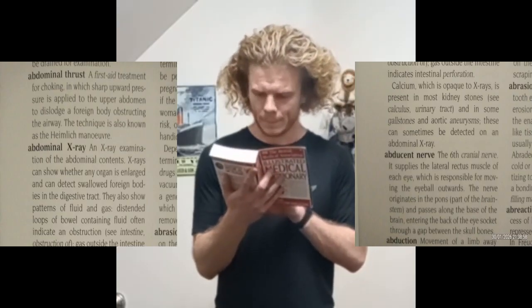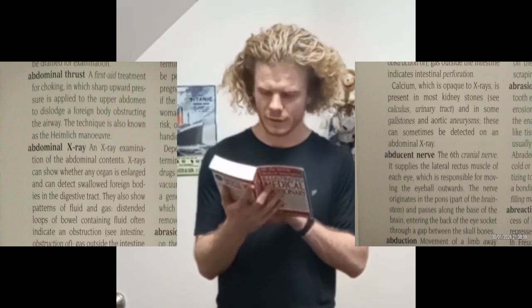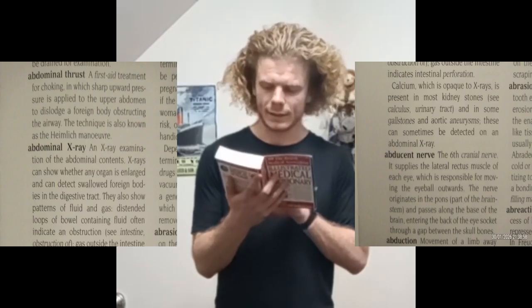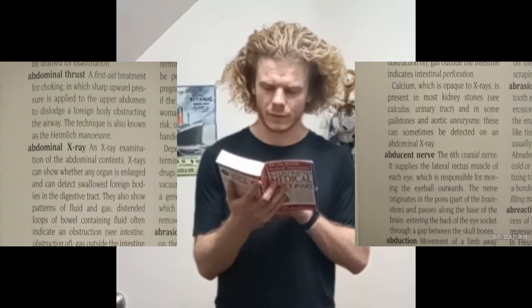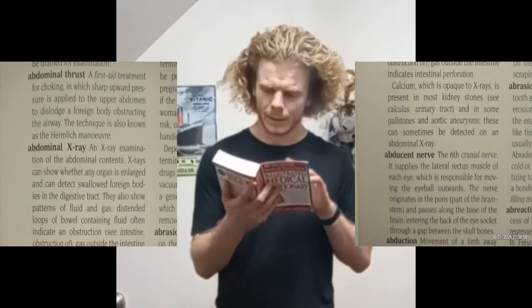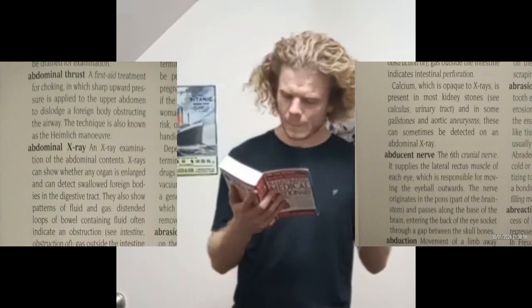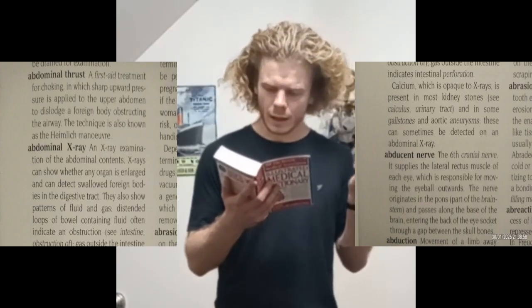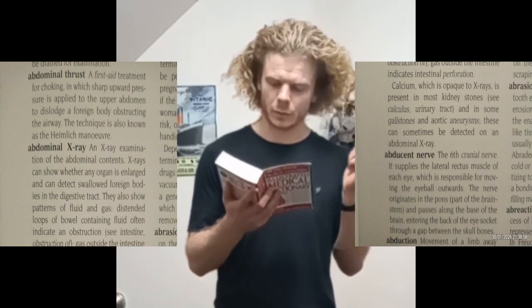Abdominal X-ray. That is an X-ray examination of the abdominal contents. X-rays can show whether any organ is enlarged and can detect swallowed foreign bodies in the digestive tract. So an X-ray is done of the abdominal contents, and it is there to look if an organ is too big and if someone maybe has swallowed an object which shouldn't be swallowed.